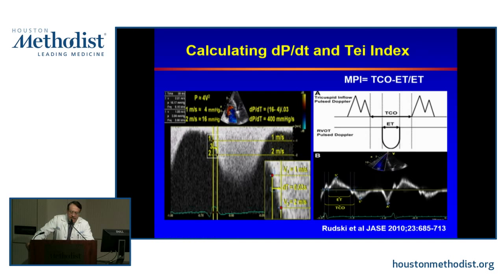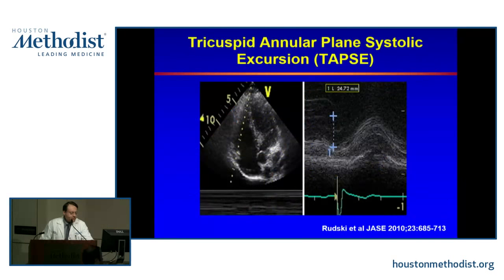And so if someone has a high right atrial pressure and RV systolic dysfunction, the isovolumic relaxation time can be shorter, which means a smaller numerator, which means a smaller value of MPI that may not cross over to the abnormal range. So for most labs, this is not done. Perhaps for research studies, it could be a value in the search for simpler indices of RV function, but is not really a pure index of contractility.